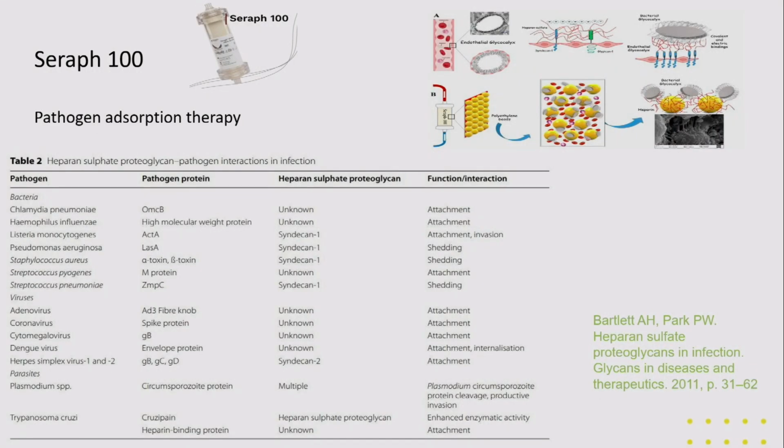So this is how the journey of adsorption has come to this end. What we talked about up till now was removal of cytokines, products of bacteria like the cell wall membranes, the endotoxins, the subcellular components. Now we are talking about removing the entire viable bacteria. This is a Seraph filter, which is capable of removing all these microorganisms.